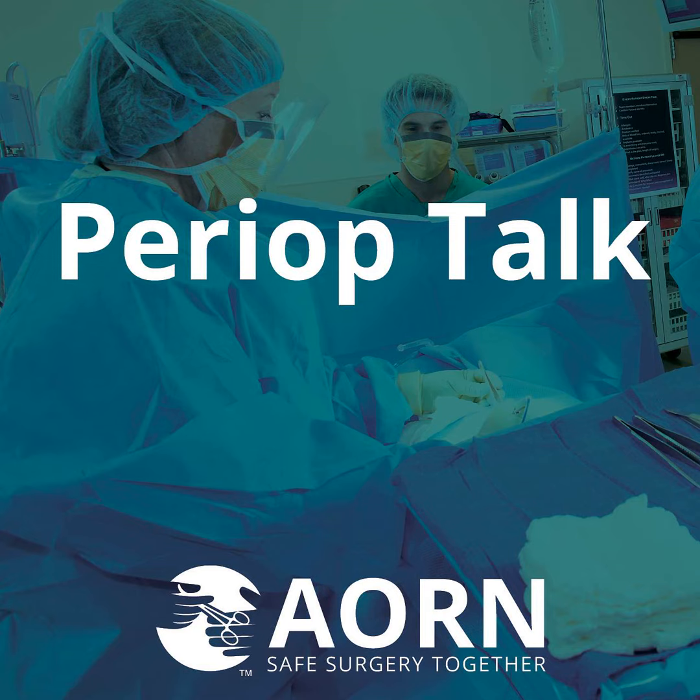And then something that's new, people may not be as aware of, is minimizing movement. Like, how do you reduce shock and vibration on the instruments? Because think about it, when we get new instruments, they come to us in the shipping packaging, then we put them in containers and we send them back and forth, and they don't have all that protection. So our instruments could get damaged, especially those fragile instruments and anything electronic, right?